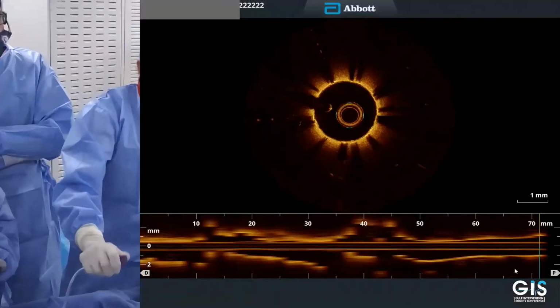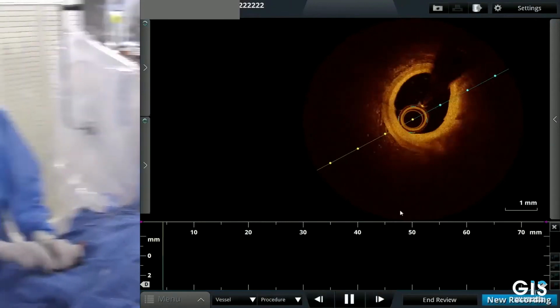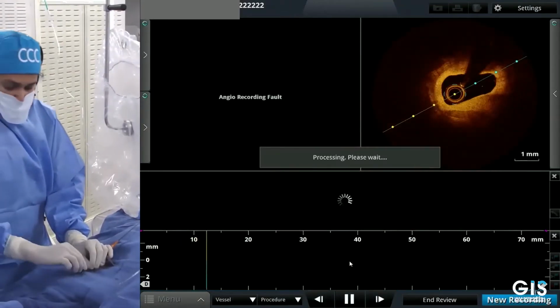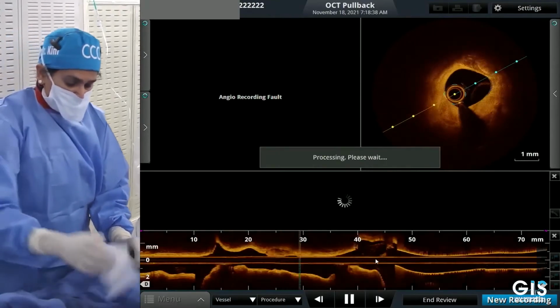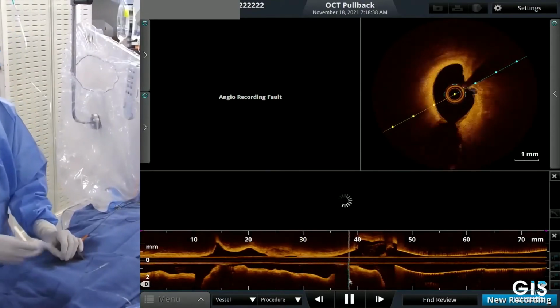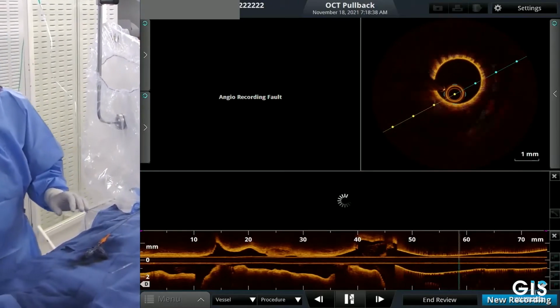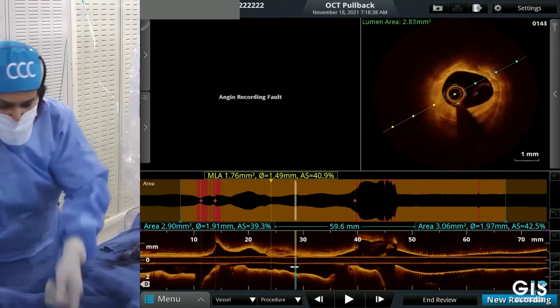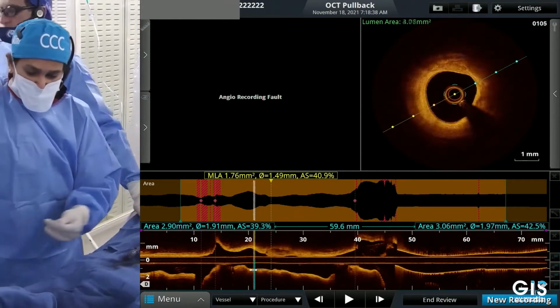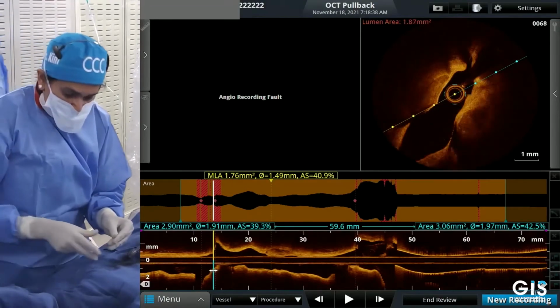Dr. Jassim, great image. All right, so we did the OCT. We're going to go live to the OCT and do the reconstruction. We have a co-registration as well available in this room, and then we're going to talk a little bit about the OCT. Okay, let's go ahead. We have our associate here with the OCT with a great result. Go ahead.